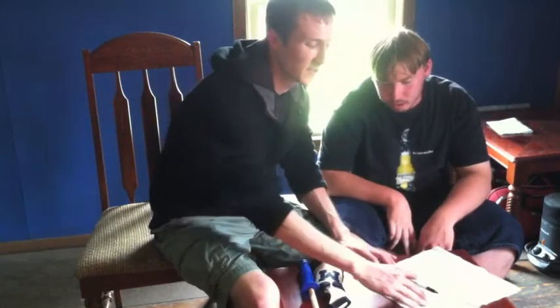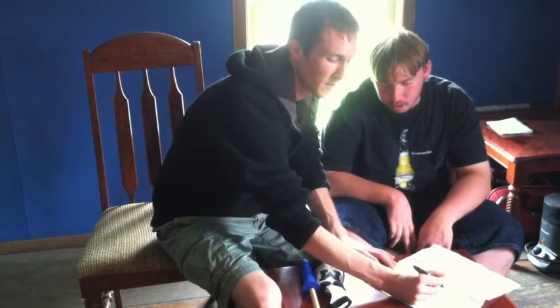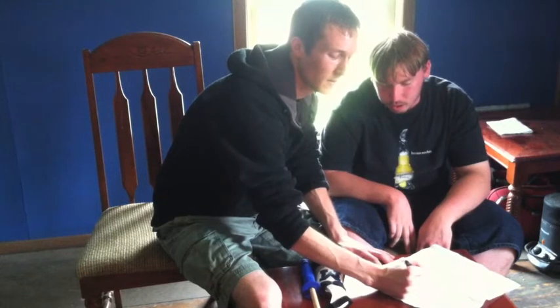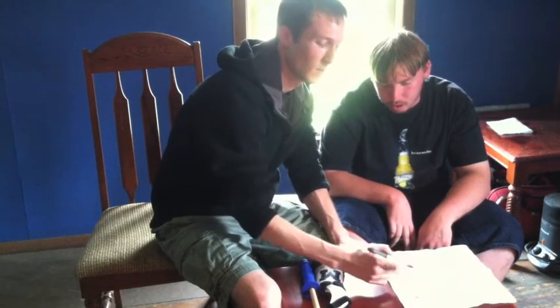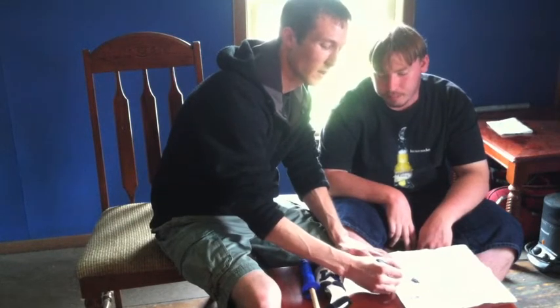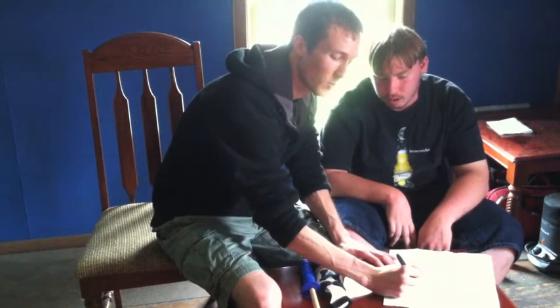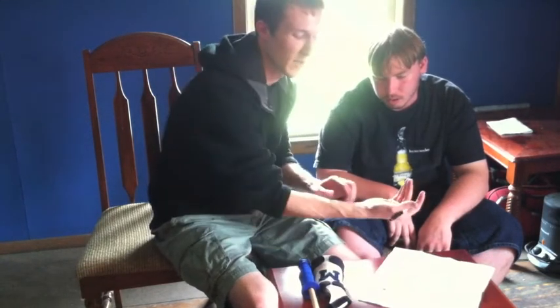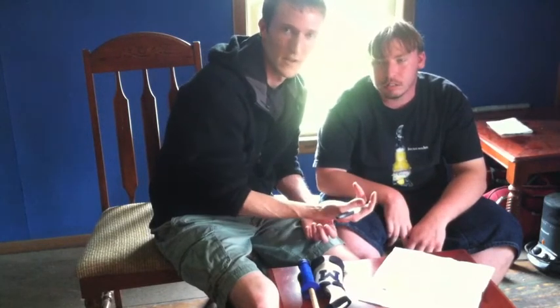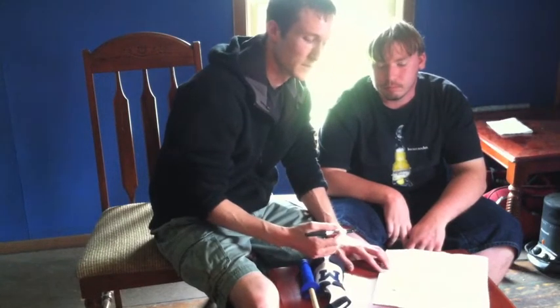Now what I'm going to do here is, from the mark that I made at the second web space, trace a vertical line down here. And then where I made the first CMC mark, I'm going to draw a horizontal line over here. Where those two intersect, that's going to be a main point that I want to pay attention to, because when we're making this splint, we're going to want to steer clear of that CMC joint so we don't create any abrasion or pressure sores in general.